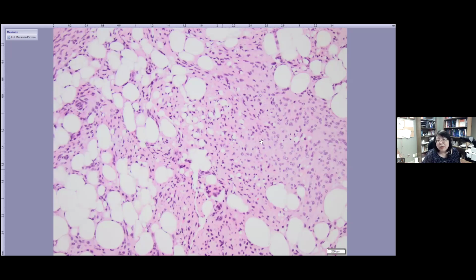You have lipo, you have fibrous tissue: lipofibromatosis. Usually in a young child, like a 1-year-old infant, the recurrence rate is high, probably up to 70% of cases recur. So recognizing this diagnosis is very important.